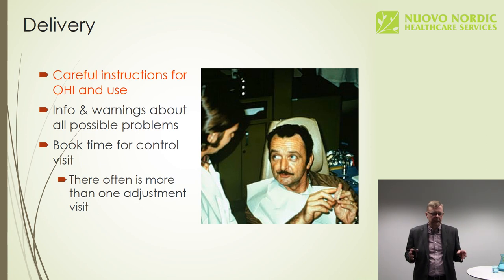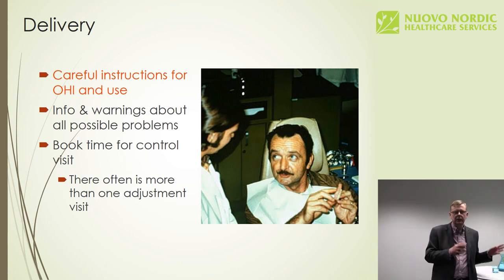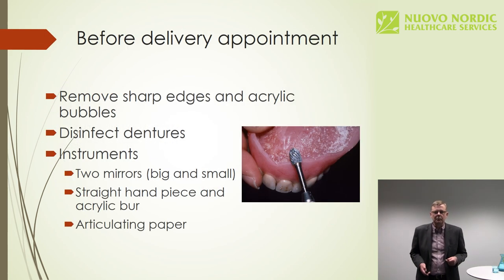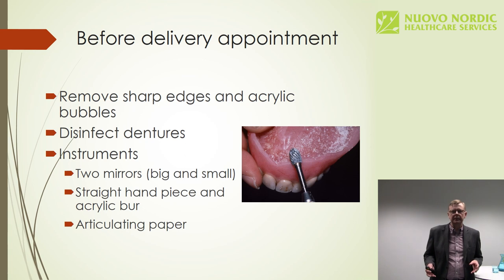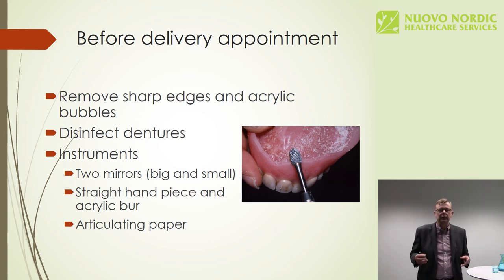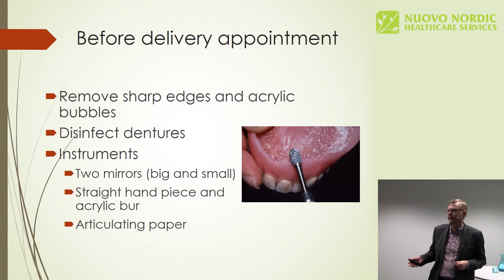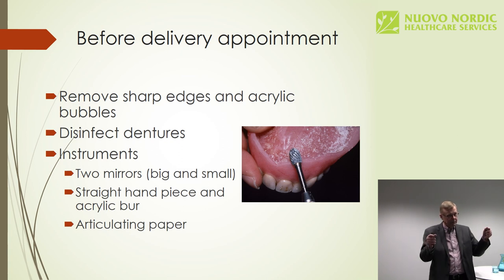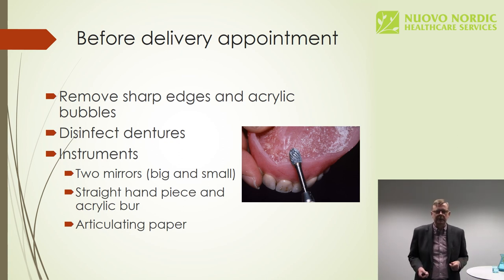And you must make sure that the patient will know that he or she will not be alone once the dentures have been given for the tryout period. We'll call it the tryout period because basically the dentures are not yet ready. The patient is only test driving them. So, before the actual delivery appointment, we'll make sure there are no sharp edges or anything that might directly hurt the patient. We'll disinfect the dentures as they come from the lab. And then we'll have a small mirror and a big mirror for the patient to view the dentures.